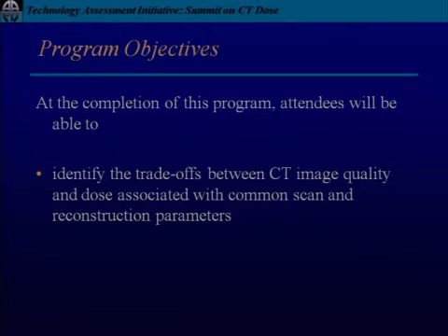But I saw that in your talk that you had used 30%. Is that something which is universally accepted within your neuroradiology section, using that level of adaptive statistical iterative reconstruction? Actually, there is no standardization with respect to that. We have only one scanner that is capable of doing this. All other scanners are not capable of doing this.